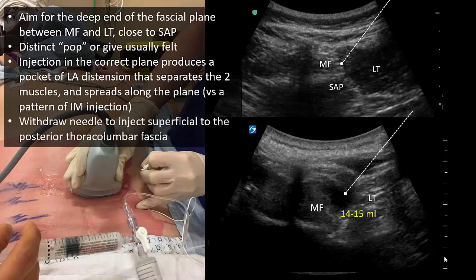Withdraw the needle until the tip is lying above the posterior investing fascia of the muscle. Confirm its position with hydrolocation again to visualize spread over the surface of the muscles. At this point, inject the remaining 5 to 6 ml of local anesthetic. Repeat the block on the other side.